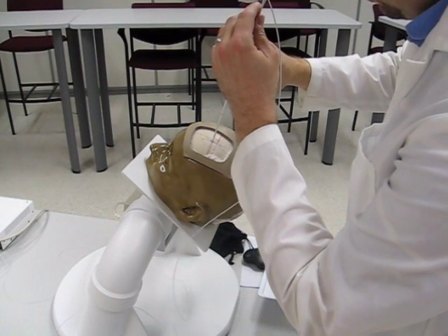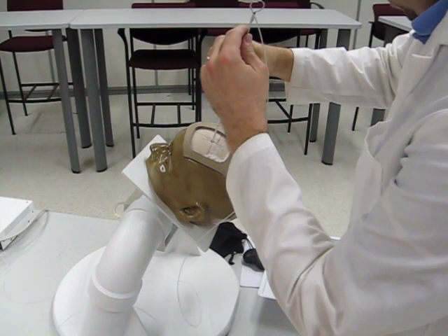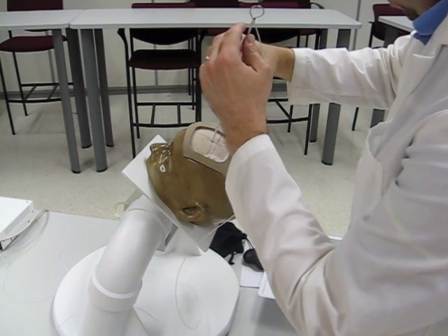If you enter the ventricle, you will hear and feel a pop. When you feel you have properly placed the catheter, stop. Do not remove the stylet inserted in the catheter.